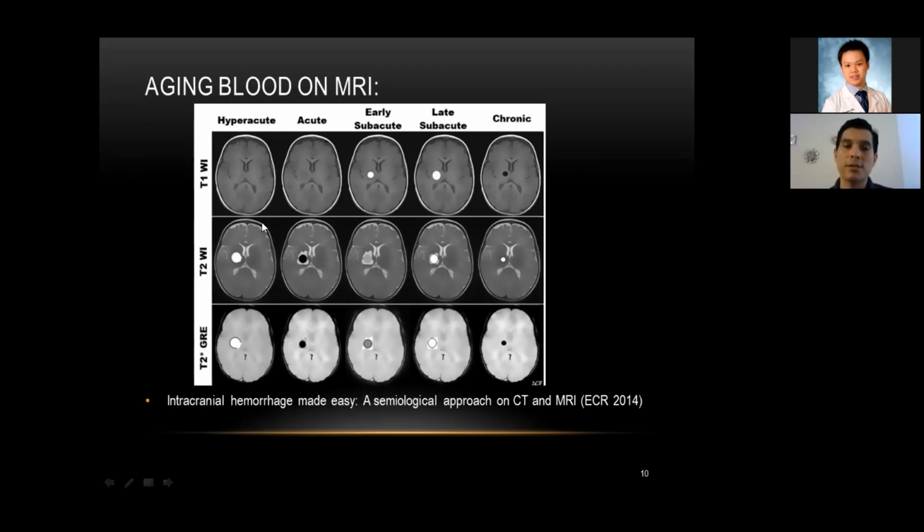in this drawing, and you have to remember maybe the first 48 hours, because it's the time that, if it is something acute, maybe you will see patients in this window. And in this window, what is important in resonance is that T1 is isointense.